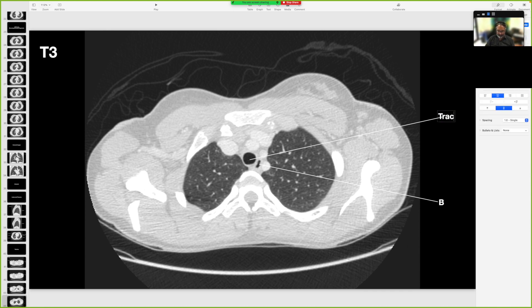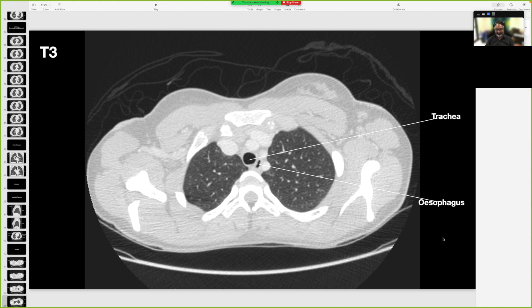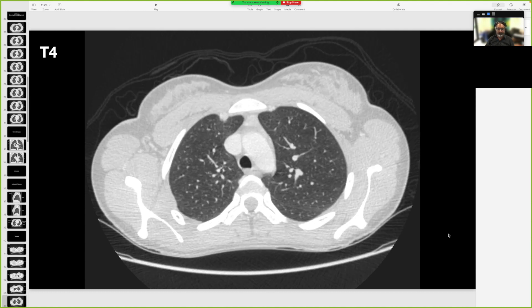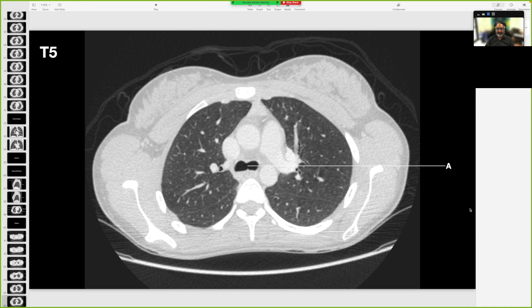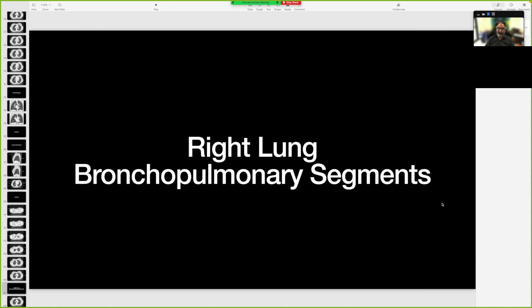A is the trachea — it's got air in it and a nice little muscle wall around it. The esophagus is right there; sometimes its lumen is open and sometimes not, but you should always be looking for it. I forgot to label it but that's the trachea, and A is the carina.